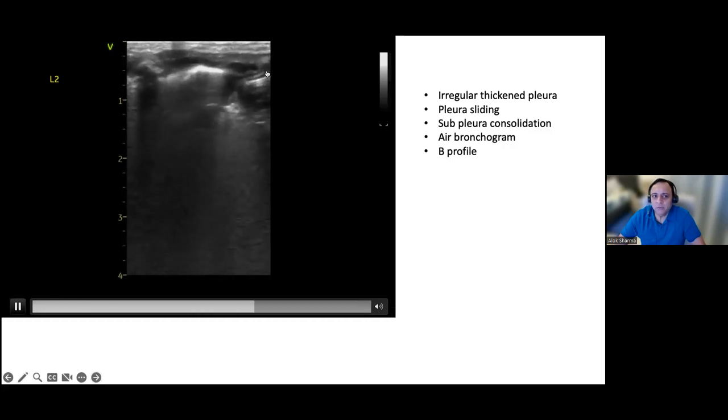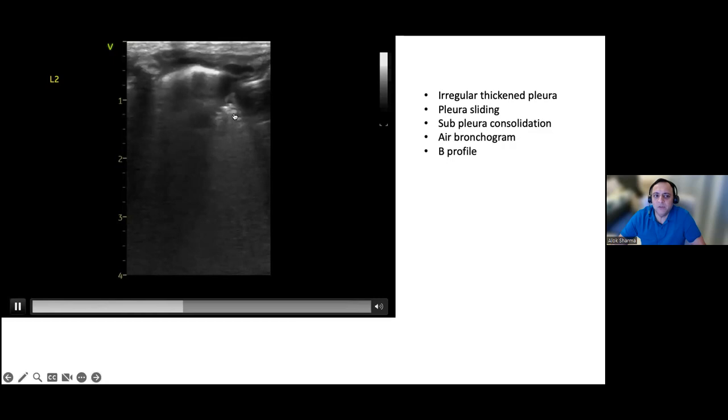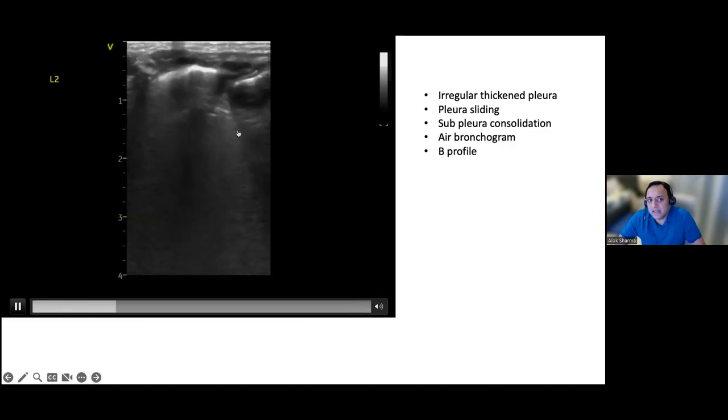So that area there is the pleural margin. And basically, then you come to the middle and you can't see pleura in between. Okay, and you've got these static air bronchograms there, no dynamic air bronchograms, with an area that looks quite dense. Now, that is liver-like, and I think it's just because you've got slightly blurred settings, but that for me is a deep consolidation. And you can see how it arises from the pleura.